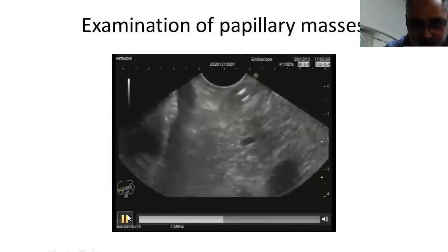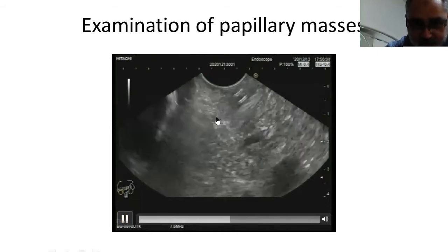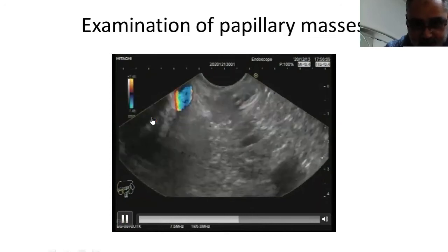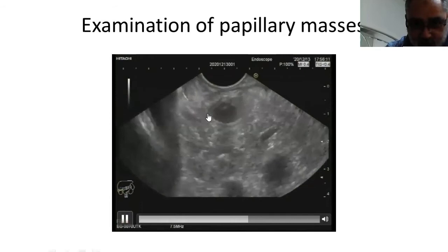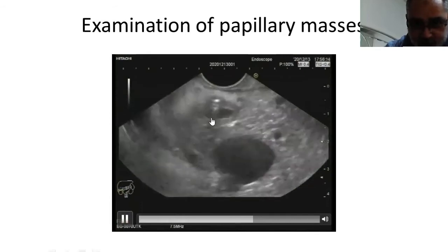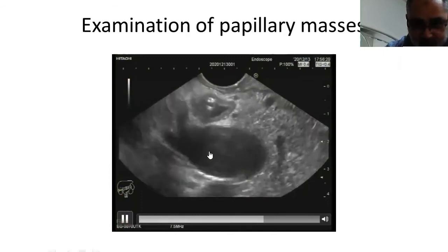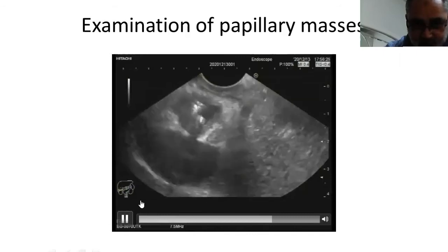With counterclockwise rotation, we can see the common bile duct, and here there is a plastic stent inside the pancreatic duct and part of the pancreatic head, and this is the aorta and IVC. So this is the common bile duct, pancreatic duct, IVC and aorta. By more and more counterclockwise rotation, we'll visualize the distal common bile duct. And here this is the venous confluence of the portal vein, splenic vein, and the superior mesenteric vein.